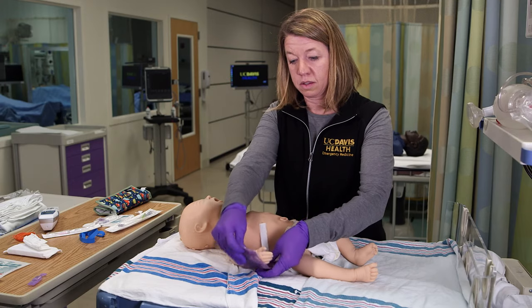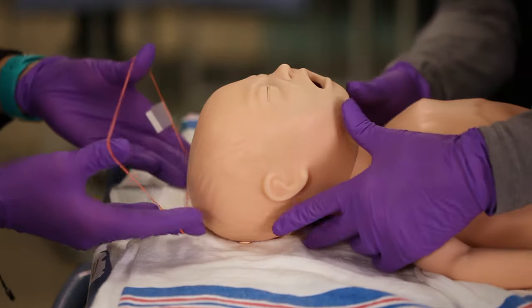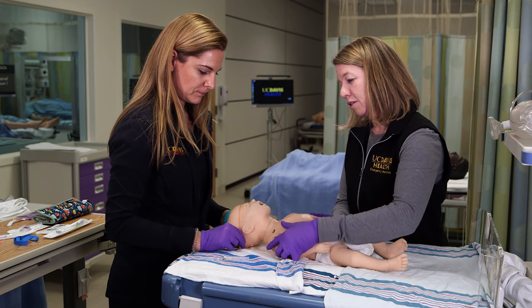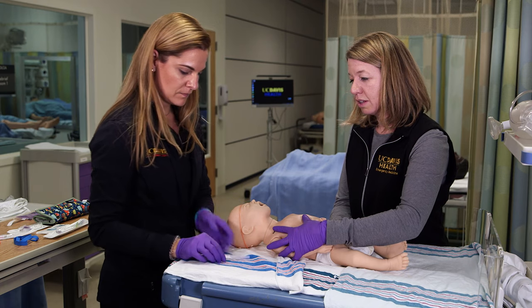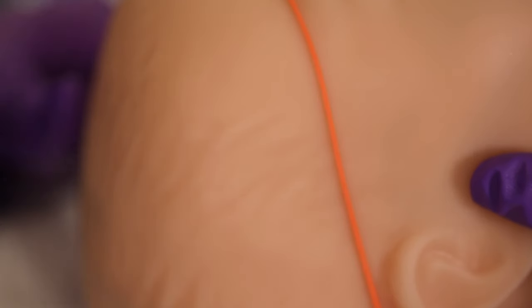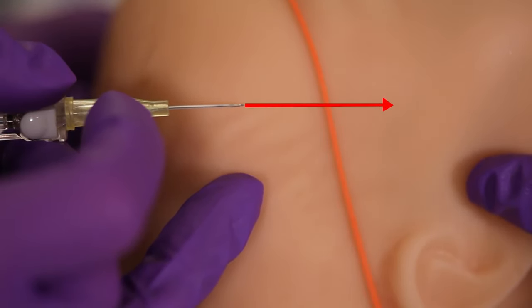Placing a warming pack on the area can also help with finding a vein. Another location you might try is the scalp, though this should never be the first option because it's distressing for parent and child. If you need to try for a scalp IV, a large rubber band can be helpful, and make sure the catheter is directed downward toward the heart.